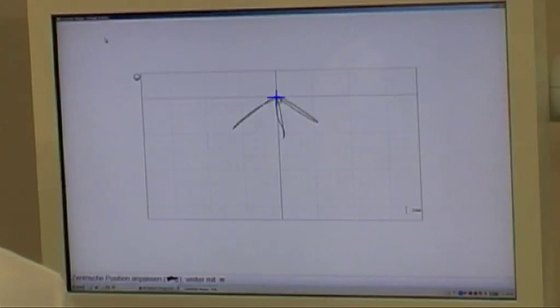To do this I restart the module and see on the monitor the actual position of the support pin as a green circle. If the centre of this circle is on the desired centric position the measurement is ended. This will fix the centric position electronically.